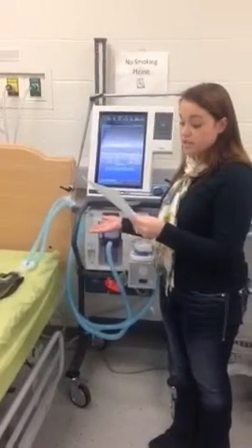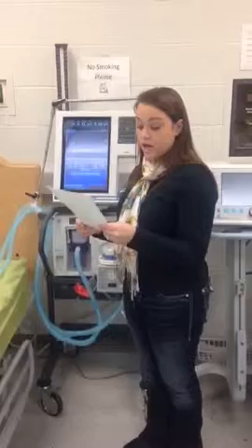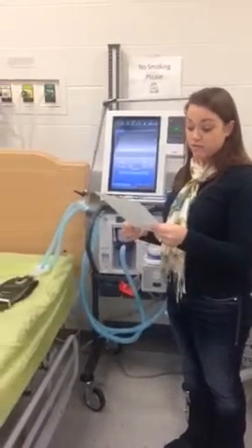Since it's a test lung, there obviously isn't any spontaneous breathing, but in this clinical simulation, she has the set rate of 10, but her total rate is 13, and her spontaneous tidal volume is 250 milliliters. Her vital signs are stable and normal for her age and cardiopulmonary disease. Her SpO2 is 91%.